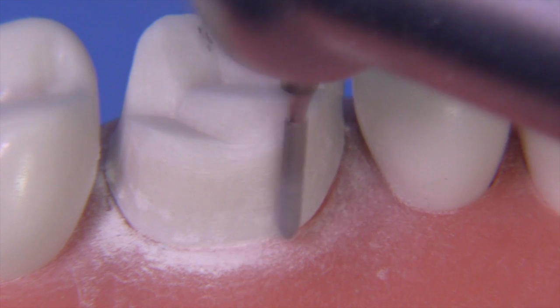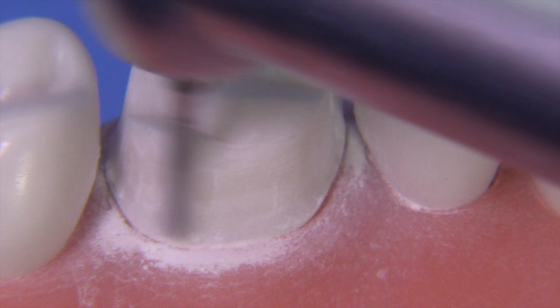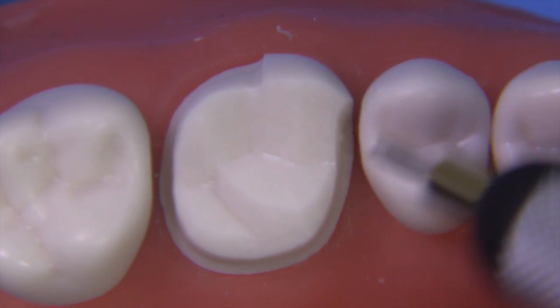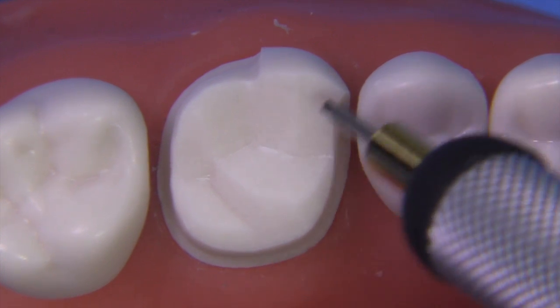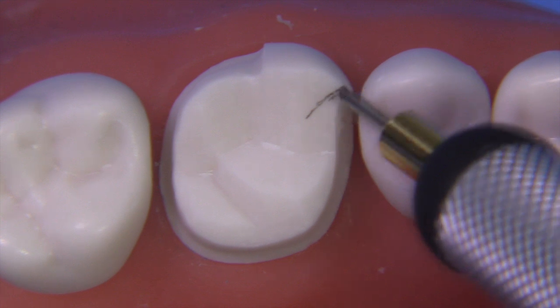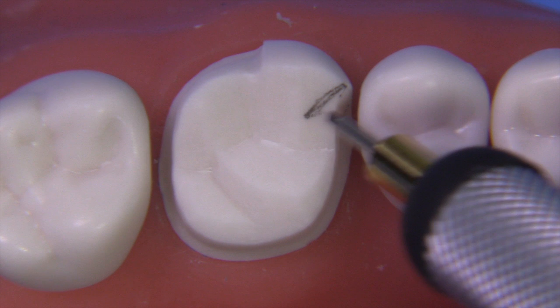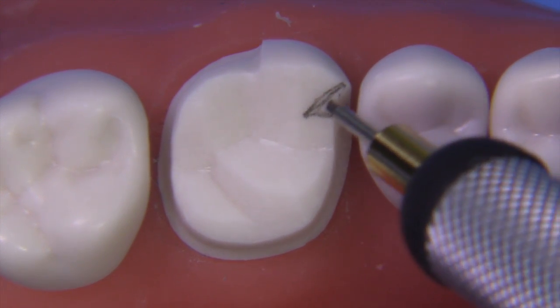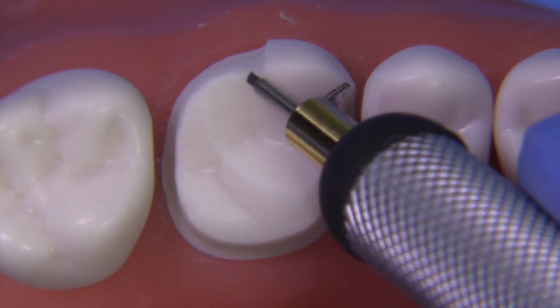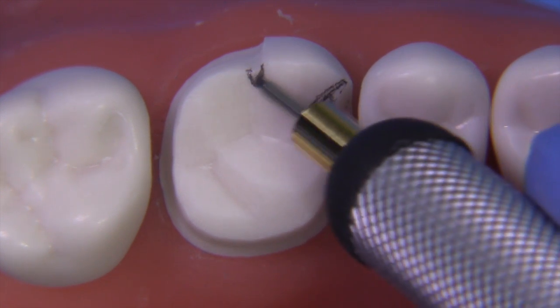Let's make the axial a little bit thicker using the 8877 010. The '010' means it's a millimeter wide — a cylindrical burr — so be careful about inadvertently creating undercuts. I mainly use this to refine the chamfer and make the axials a little deeper. Now we're going to make a little triangle between the axial wall, the flare angle, and a line that goes mesial-distal. The groove will be located right in that area — I call this the triangle of success.